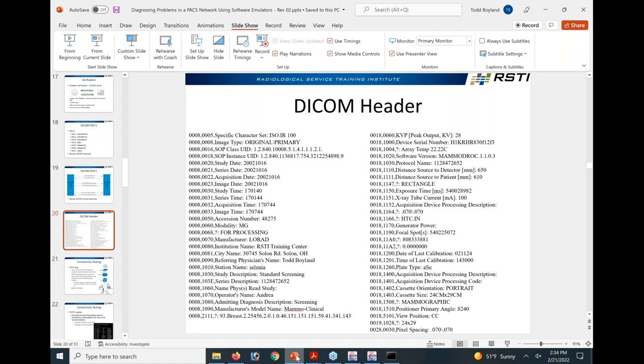All of this right here, zero stuff. That's a command to store an image. And US means unsigned, so it has to be positive.